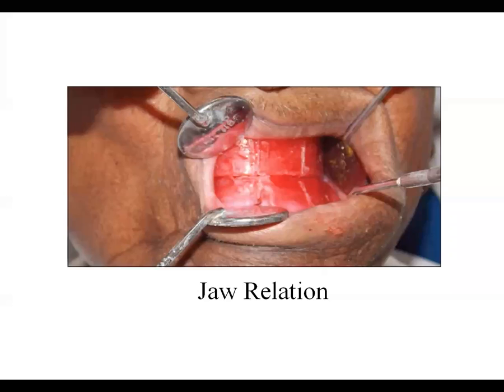The maxilla is oriented differently for every patient. So we have to record and transfer the relation of the maxilla to the base of skull on the articulator.